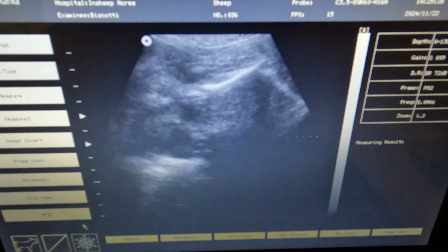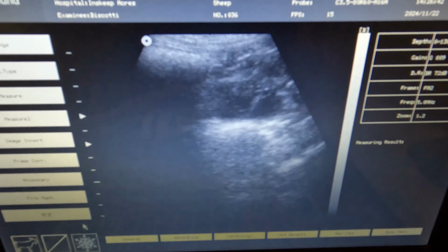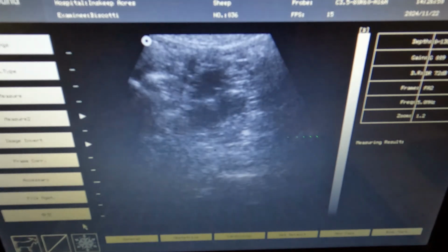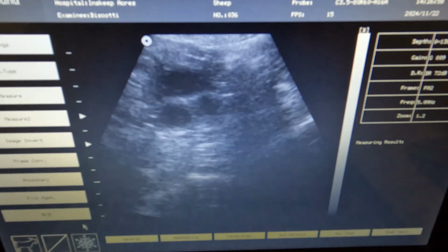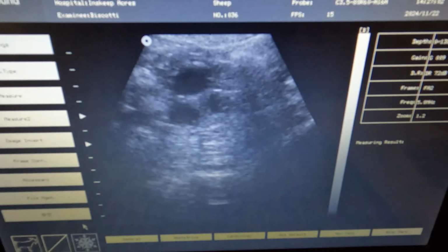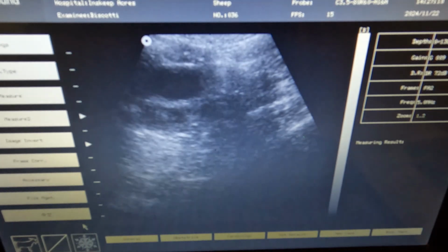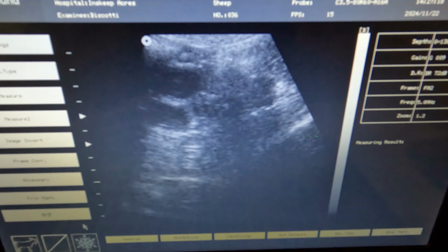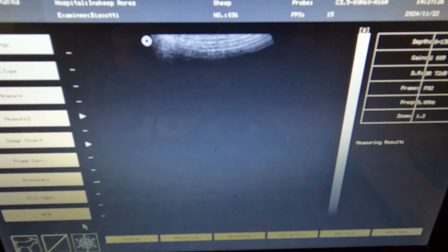May not have very much ultrasound luck today. Looks like we're not going to see a whole lot with Biscotti today either. Nope. There's one in the bottom left bubble. I think I see movement in all 3 of those. Oh, I had to push really hard up to get pretty deep in there to see that, but I'm gonna write down 3 for Biscotti.